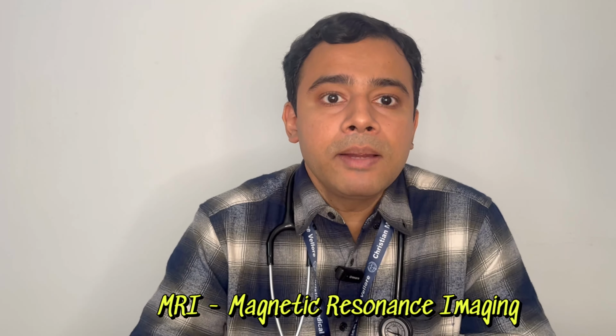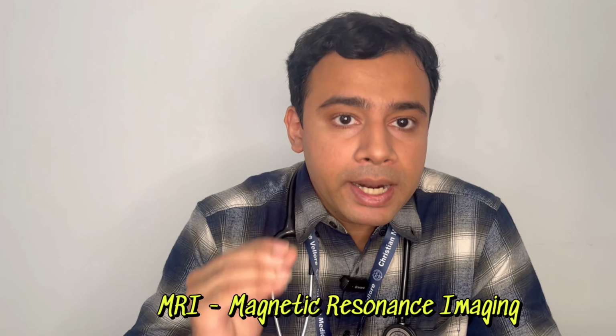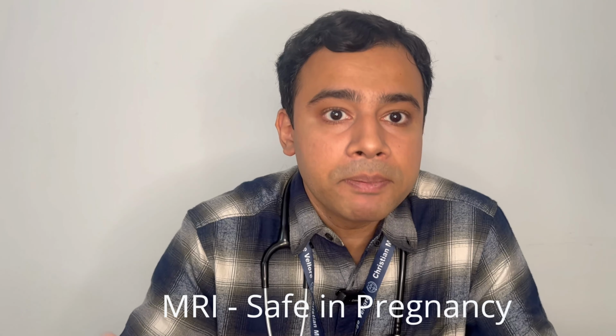Okay, so then the next common imaging modality, I think you all know, it is MRI. MRI is basically magnetic resonance imaging. Okay, if the patient is pregnant, then we usually have to go for MRI. Okay, because X-rays and CT scan are not safe in pregnancy. Okay, MRI is absolutely safe in pregnancy.